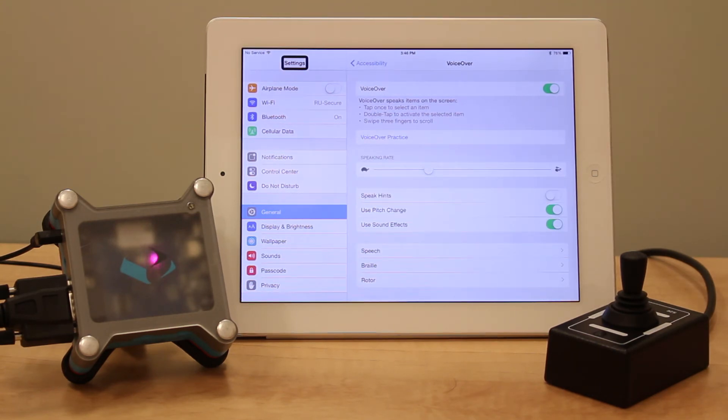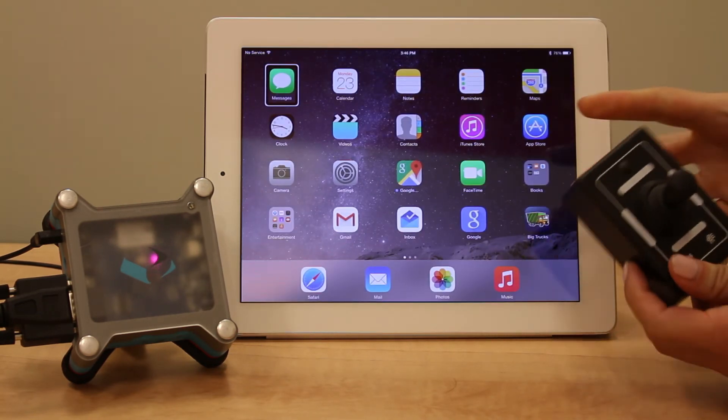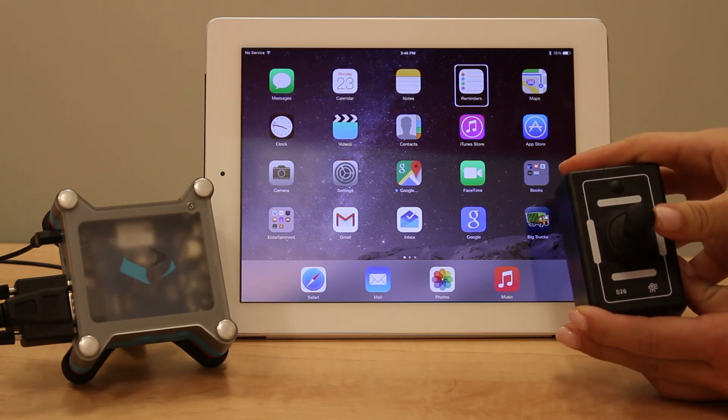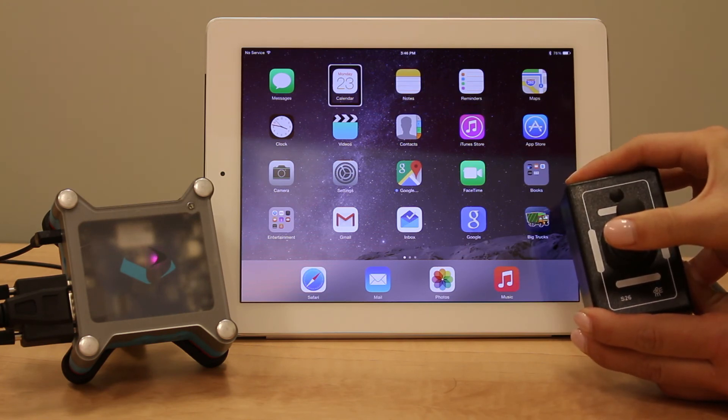You'll see a black frame around an item on the screen that you can now control with the Tecla Shield and a joystick or multiple switches. In this mode, you can move in every direction by pressing up, down, left, or right with your joystick. To select an item, press and hold forward.